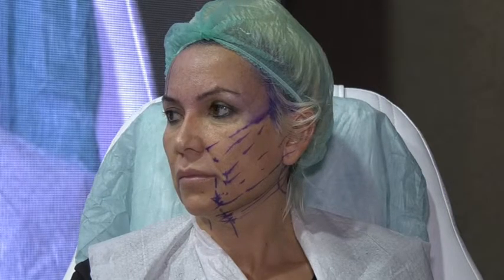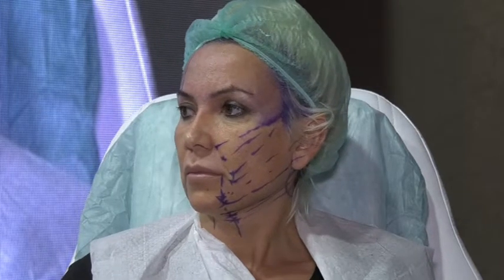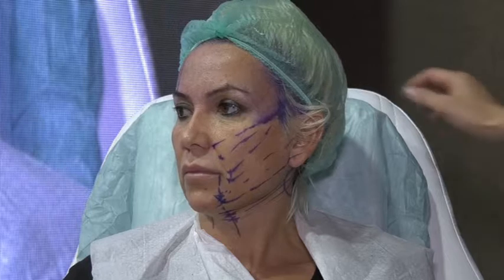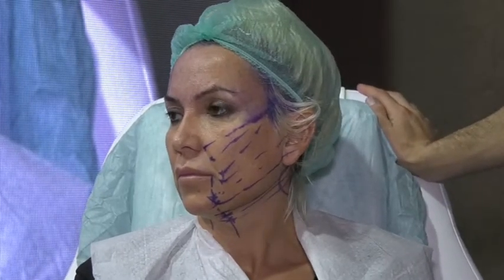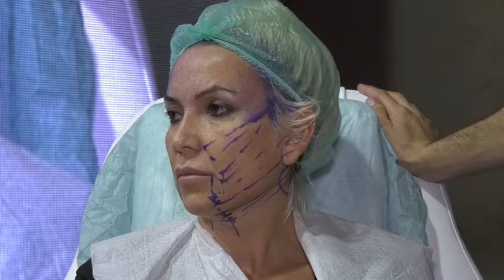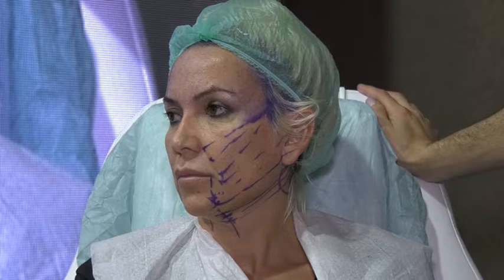The patient had a surgical facelift before. Do you do it? Yes, I did. What about edema? No, there is no edema. Thank you, doctor, for this point. The doctor is asking if the patient has had previous facelifting. I did many cases that have a previous history of facelifting.